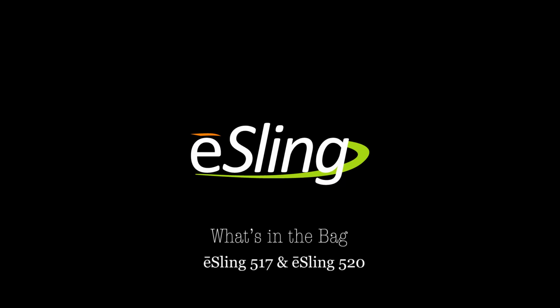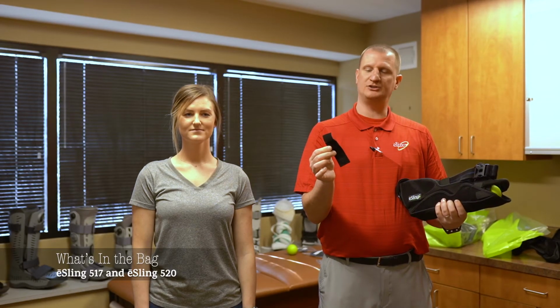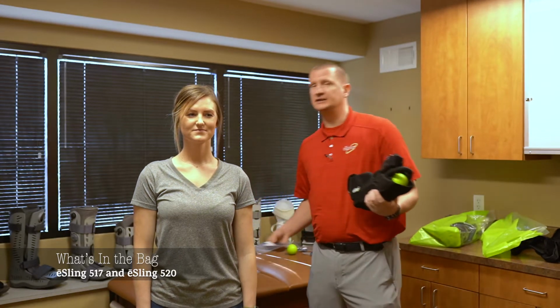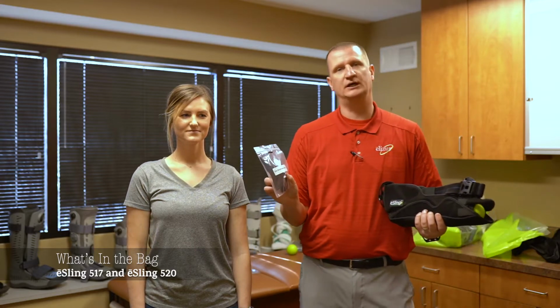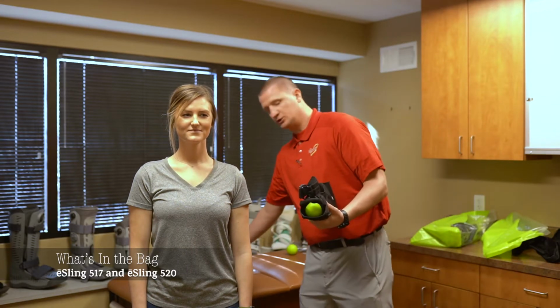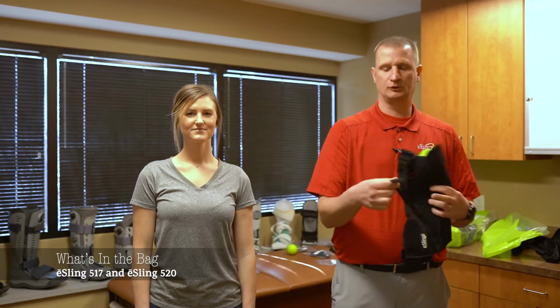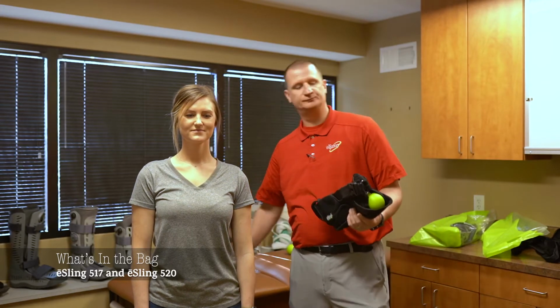The standard comes out of the bag equipped with a bicep strap. This bicep strap will come in three lengths, a medium, and then inside the bag you'll have a small and long, depending on what the patient's arm size is. Also with the sling you will get an optional thumb strap, which will go in between the thumb to keep the wrist from falling down.